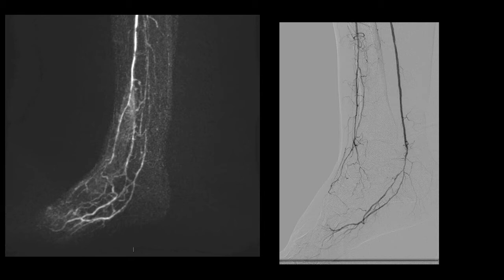And in this case, it very nicely shows the occluded posterior tibial artery, which went on to get angioplastied to restore flow into the foot. We knew this was our best target rather than the occluded AT because of the distal dorsalis pedis occlusion.